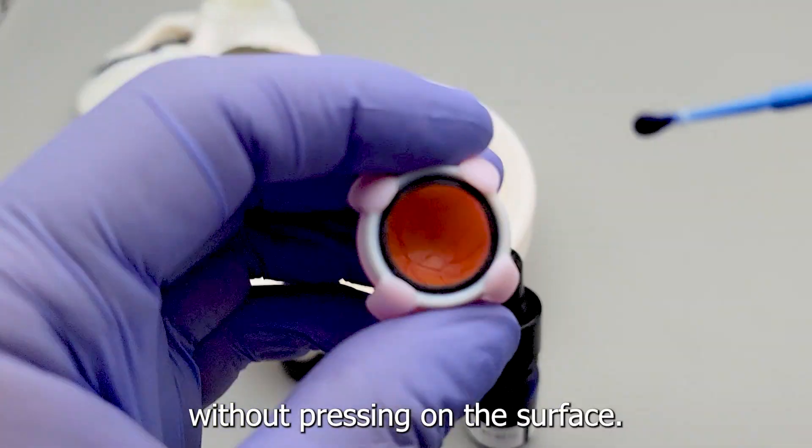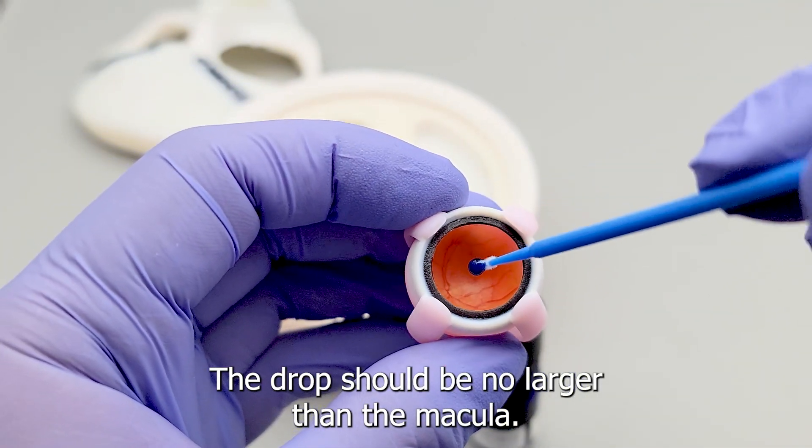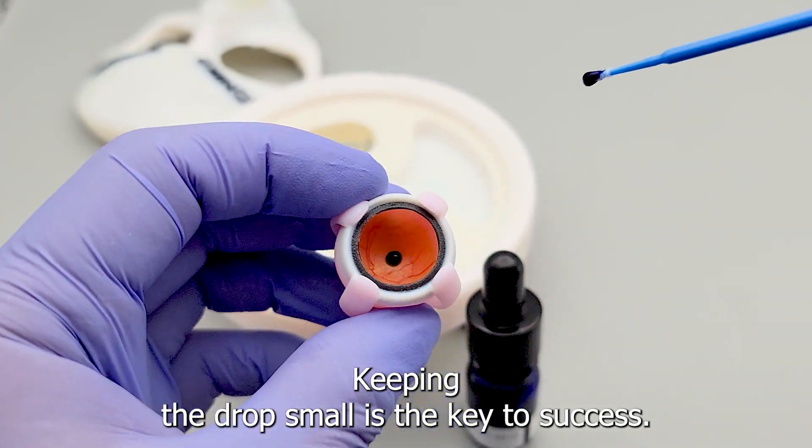Without pressing on the surface, the drop should be no larger than the macula. Keeping the drop small is the key to success.